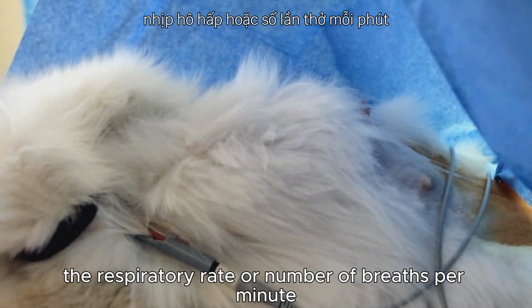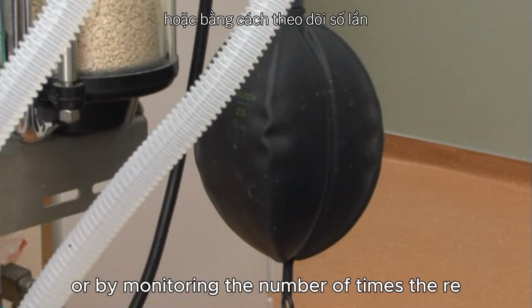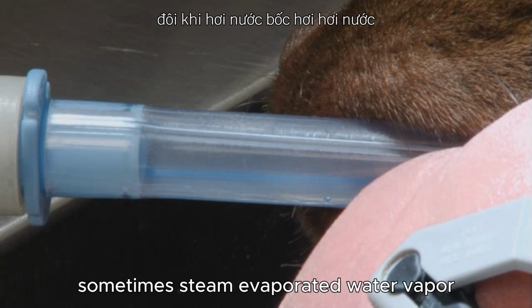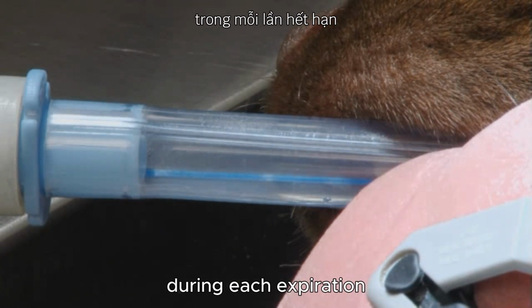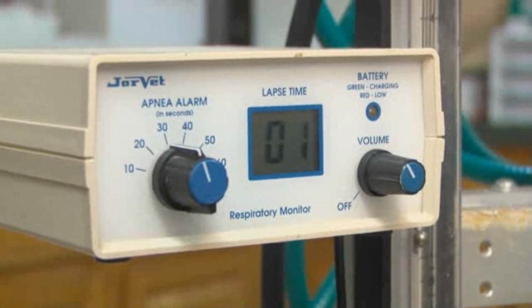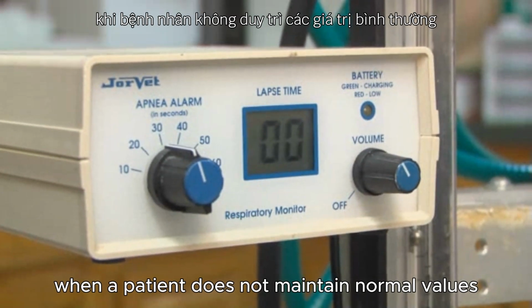The respiratory rate, or number of breaths per minute, can be evaluated by either watching the chest move up and down or by monitoring the number of times the rebreathing bag inflates and then deflates. Sometimes steam, evaporated water vapor, can be seen on clear endotracheal tubes during each expiration. Respiratory monitors provide an audible signal with each breath. Many heart and respiratory monitors are equipped with alarms that sound when a patient does not maintain normal values.